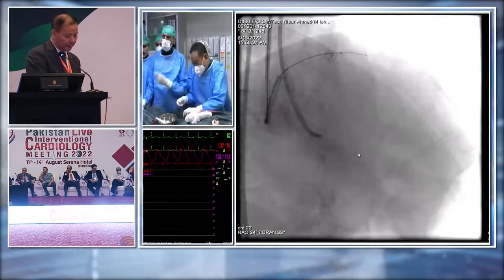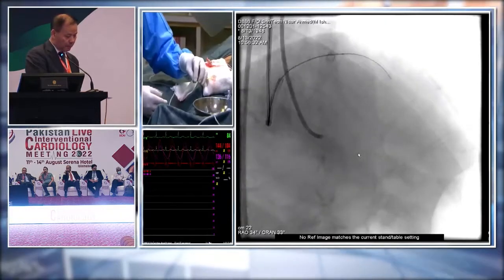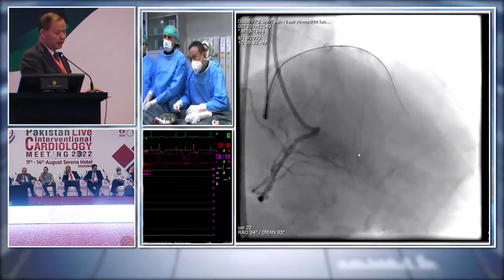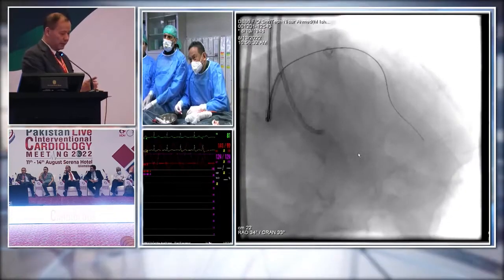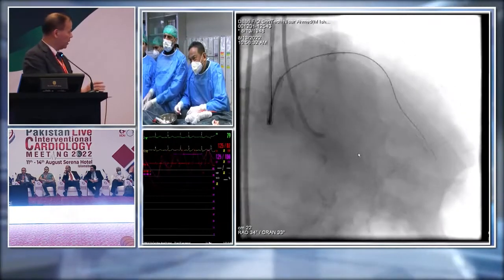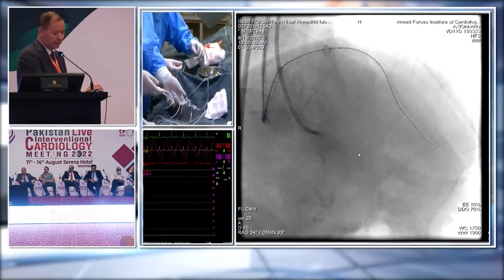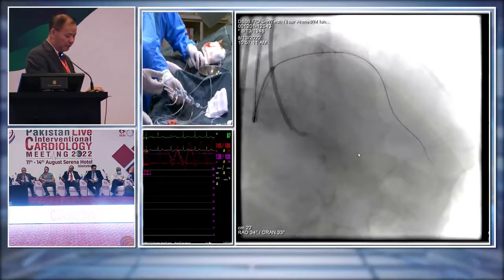No difficulty. Yeah, you can see the microcatheter does come down. I mean, the wire is coming up. So I'm very careful with this Conquest Pro. You don't want to cause any dissection. But never mind. Sometimes for a CTO lesion, if the CTO wire successfully crosses the lesion, we have two options. One is to change, and the other is don't change the CTO wire. For example, in this case, there's very strong difficulty to put the microcatheter in, right? So we can also use a 1.5 or even 1.25 balloon to pre-dilate. After that, it would be very smooth to use the change. Because it's a complex approach, it's very sensitive, so we should always be very careful about it.